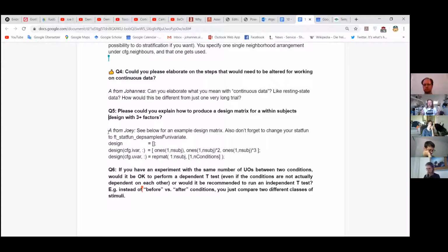So you can look, for example, without having to pre-specify that you want to look at alpha or gamma, you can use clustering, and then you can also increase statistical sensitivity without pre-specifying the frequency range of interest. So as such, a lot of the similar techniques apply, but it's just the structure of the data is slightly different in continuous data.